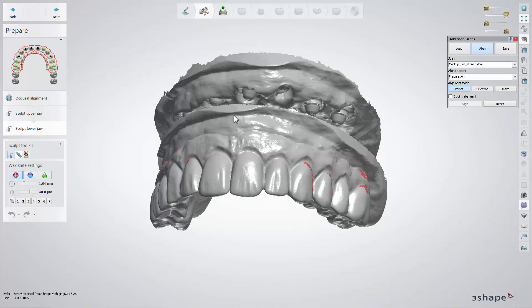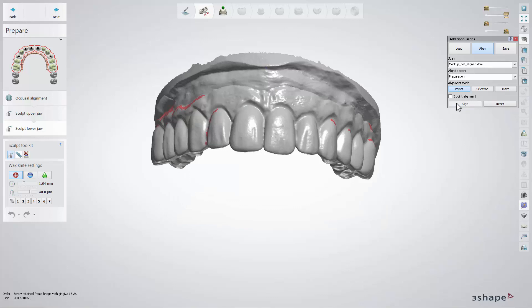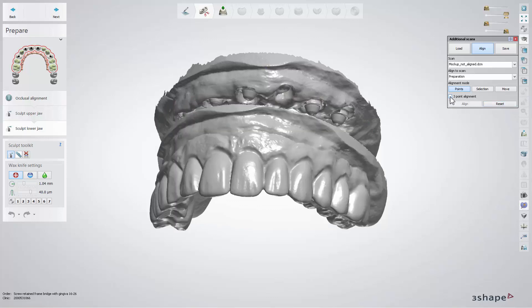One point alignment is the default. Alignment can always be reset, and three points alignment is available when the box is checked.